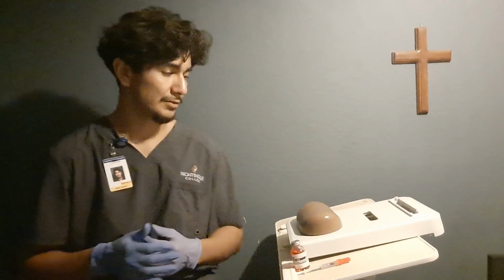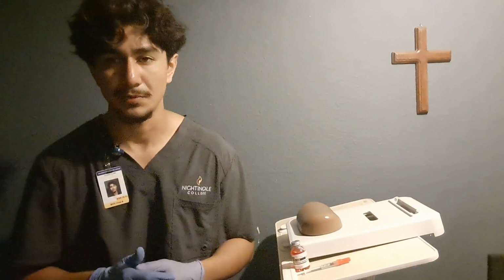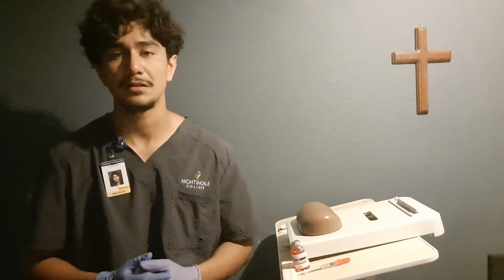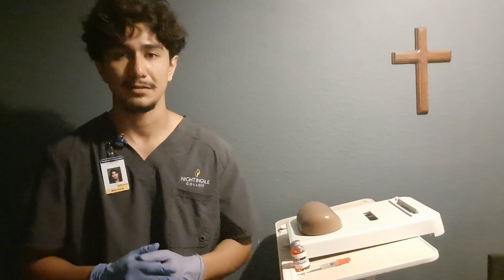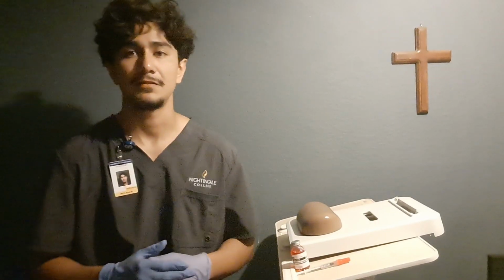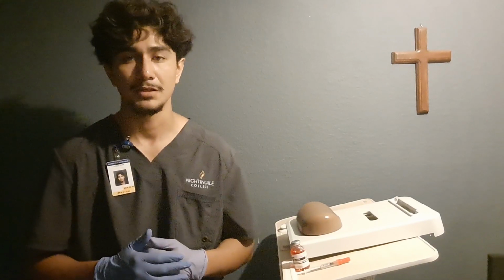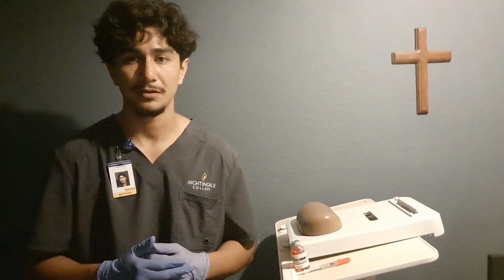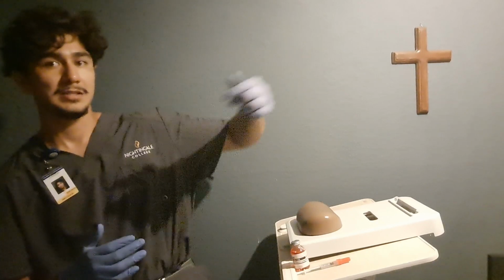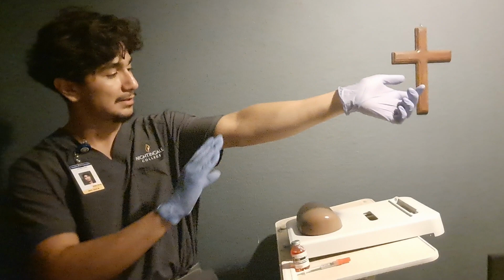and then we're gonna go ahead and choose the side where we'll be injecting. So we can inject on the patient's forearms, or we can inject on the patient's upper back. I'm gonna go ahead and demonstrate as if I'm injecting the patient's forearm. So when choosing the patient's forearm, the first thing you're gonna want to do is go ahead and look at the patient's forearm, assess the patient.